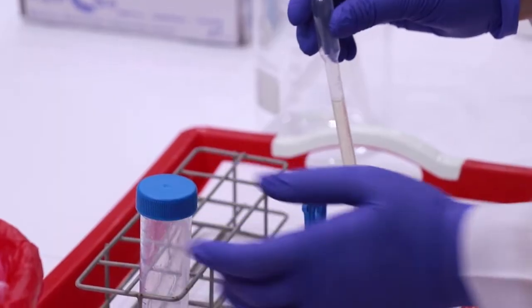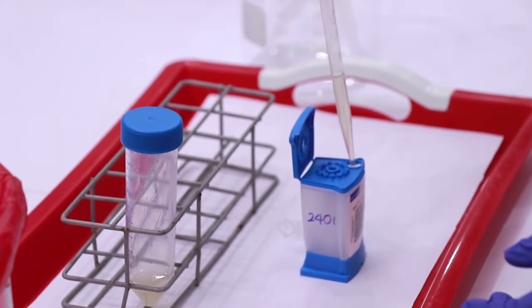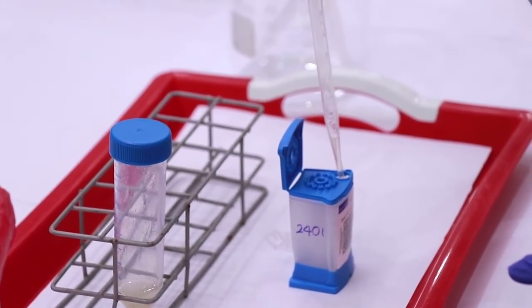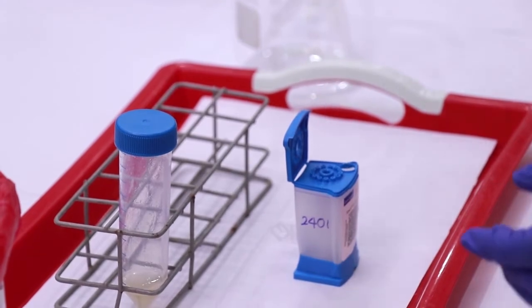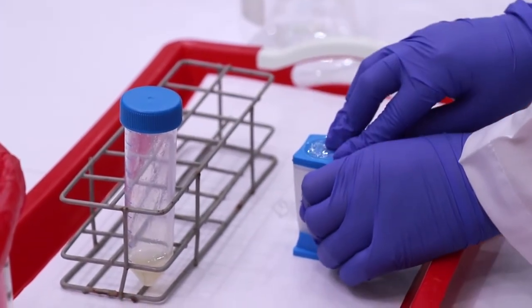Open the Xpert MTB-RIF cartridge lid. Dispense the sample reagent mixture into the open port of the cartridge slowly. Be careful not to get bubbles, as this could lead to erroneous results.